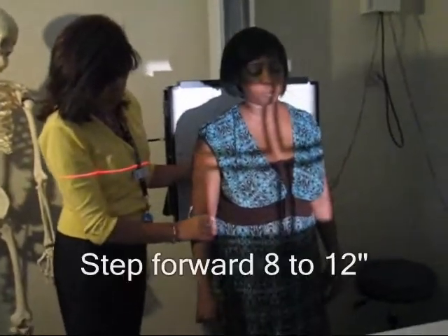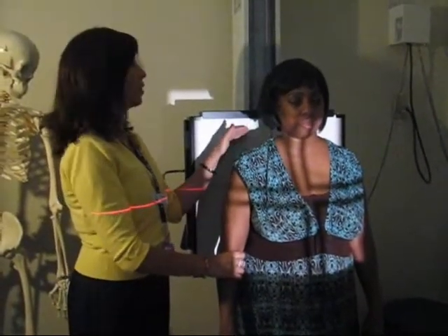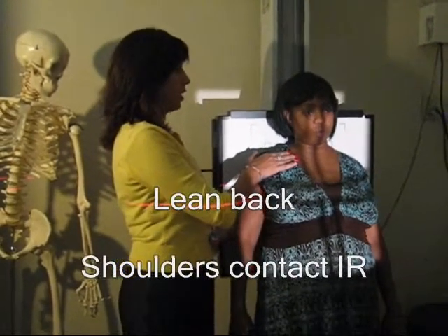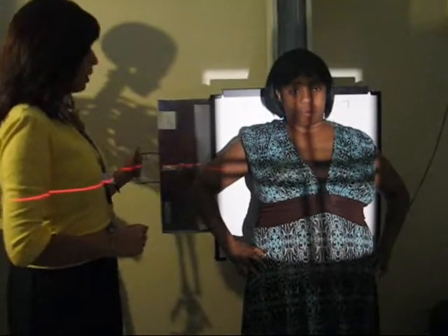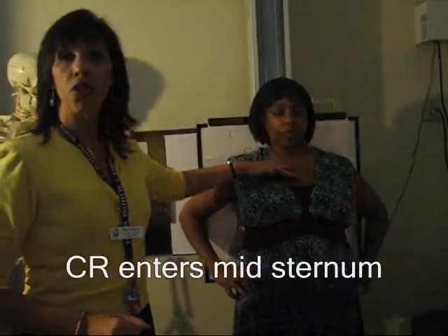Have them step forward about 8 to 12 inches away from the IR, and we're going to have them lean back until their shoulders touch the IR. Okay, they're going to put their hands on their hips. Same way, it helps stabilize. And we're going to direct the central ray about mid sternum.